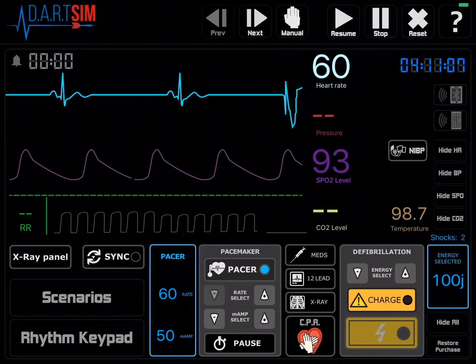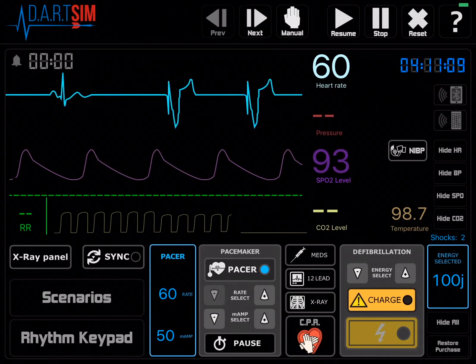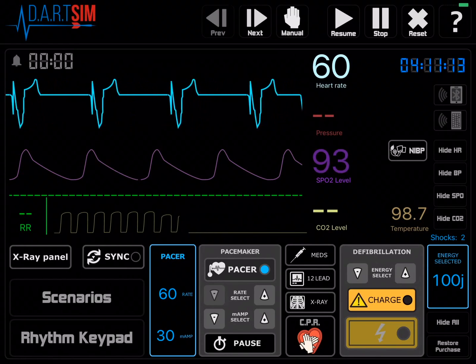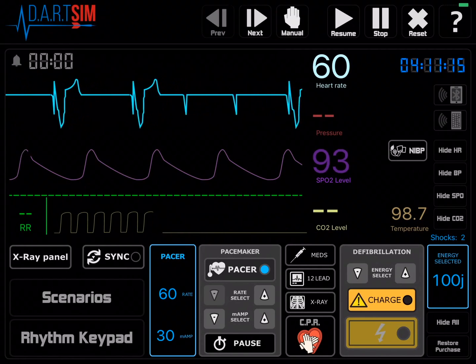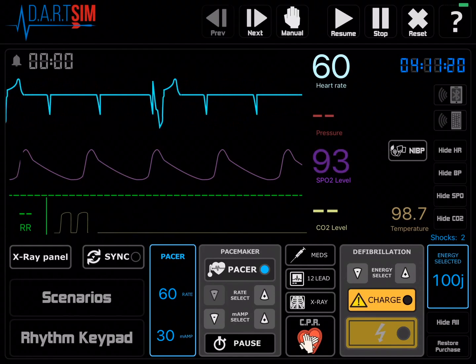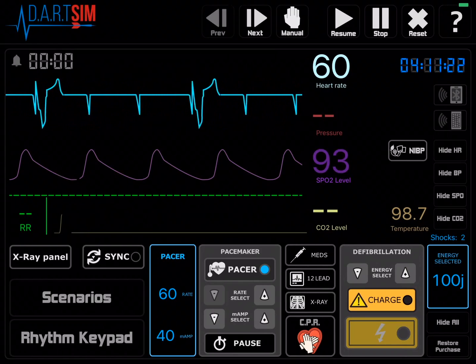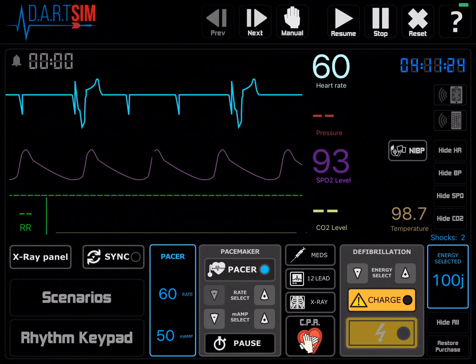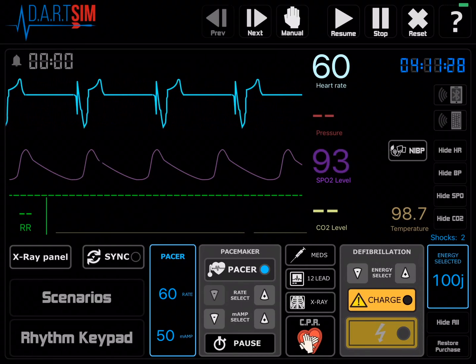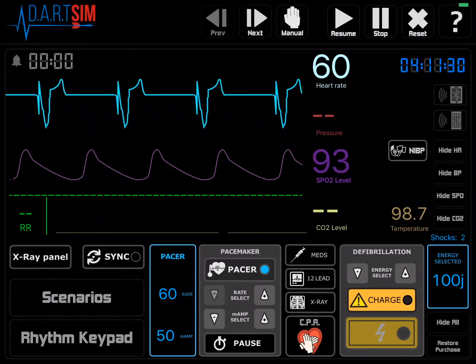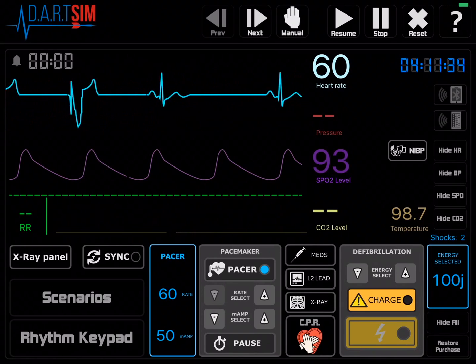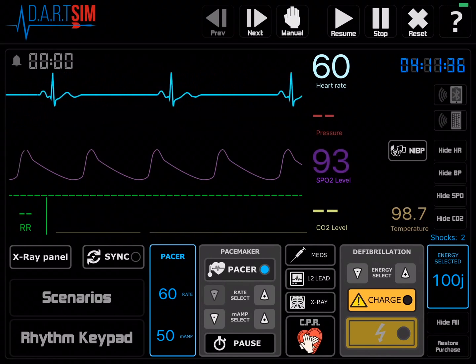One thing to be aware of: if you pace with too little energy, you may not get capture after each pacer spike. Here we have the energy at 30 milliamps and there are pacer spikes, but there's no ventricular response. So you need to turn it up to get capture after every pacer spike. If you ever need to, you can always pause to see the underlying rhythm, and then hit pause again to resume the pacer.